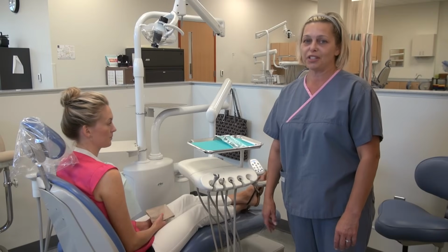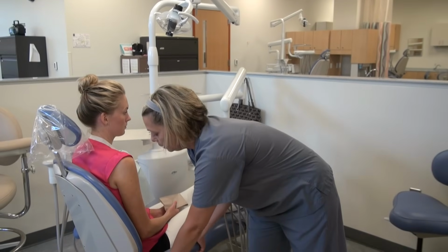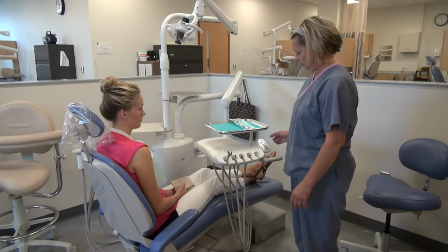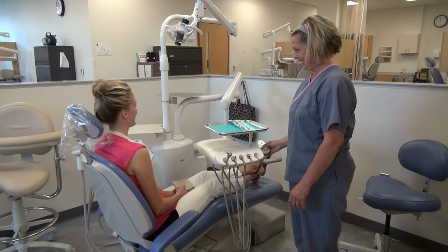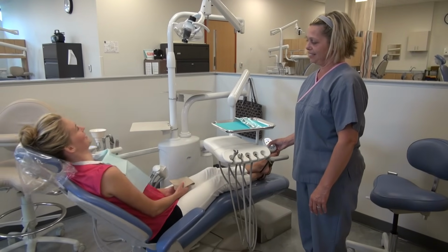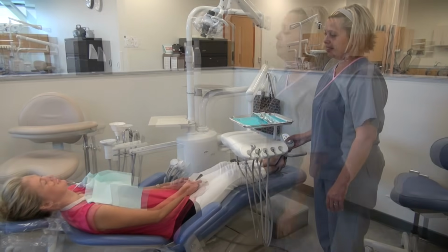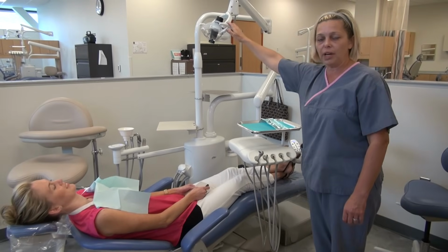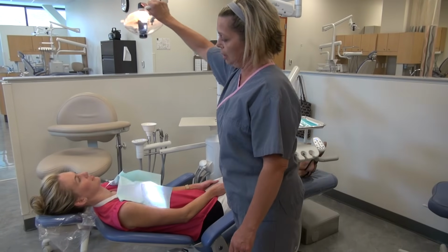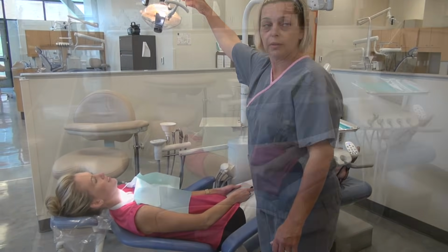Now we're ready to adjust the patient to the supine position. You want to make sure that you're telling your patient that we are going to recline them now. I'm going to recline you now. Now you can adjust the overhead light by turning it on, bringing it to the patient's chin, and then turning it off.